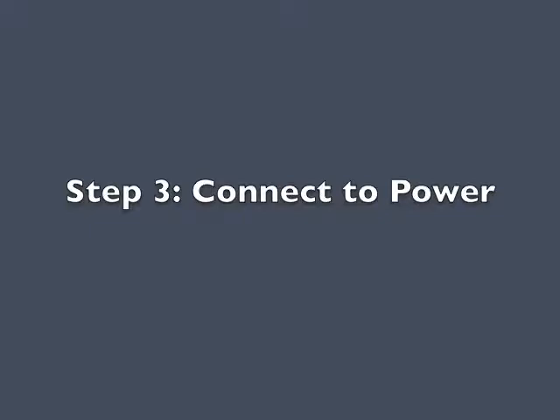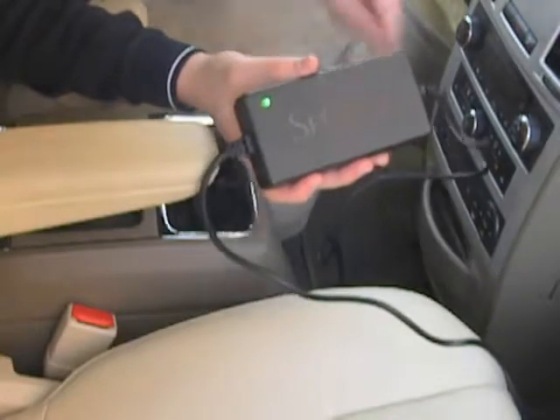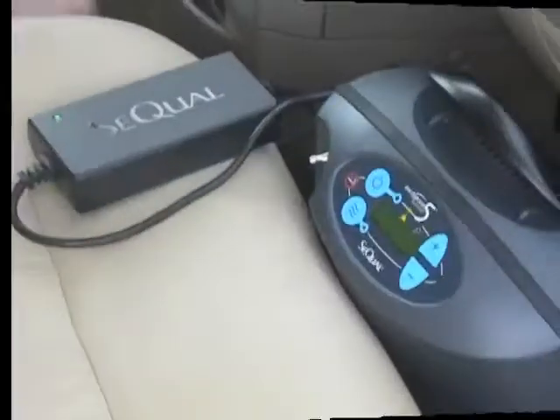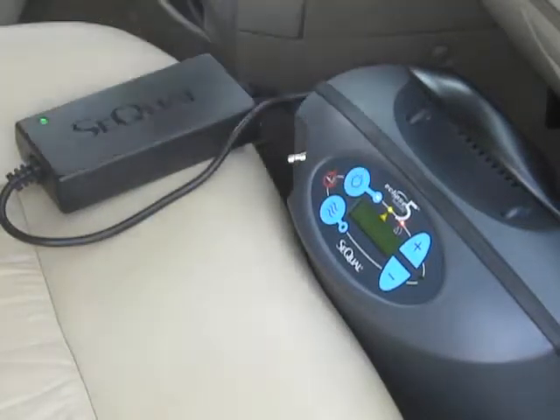In this video, the DC power supply is already connected to the side of the Eclipse. Note that as soon as we plug it in, the green light on the power supply brick lights up, indicating we are drawing DC power. Turn on your Eclipse by pressing the power button and holding it and releasing for just a second.